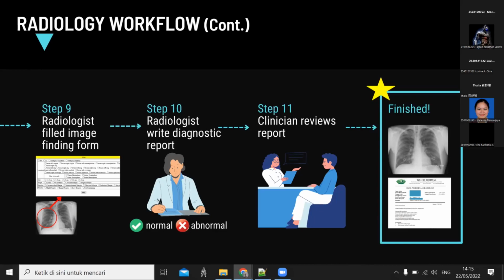But the reason why they are using TXT or PDF is because it is easier to be opened in many different systems, and it is also easier to be shared to other people. But actually, the DICOM structure report is a bit difficult to be processed or analyzed. So here we are going to introduce the implementation of FHIR standard for the radiology image exam workflow.